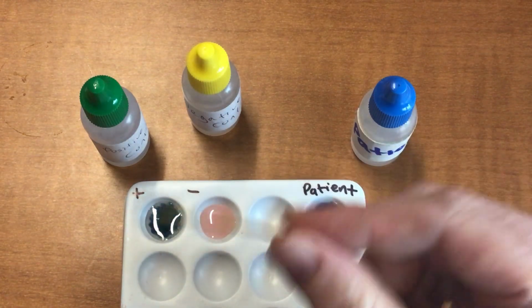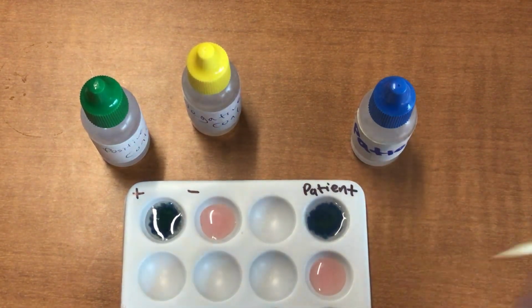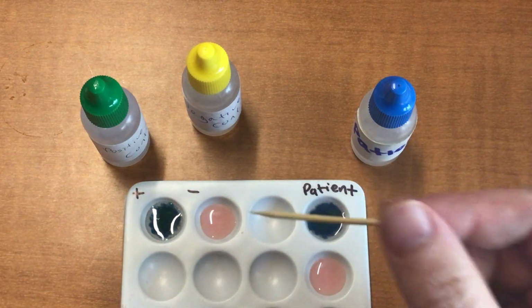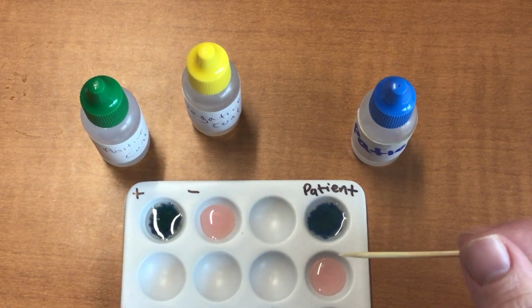And what they'll do is take a photograph of this, take a scan of this, and send it back to the doctor, and the doctor will know, all right, our patient compares to positive salmonella, or our patient compares to negative salmonella. And that's one of the ways that chemical testing is done to see if patients have a disease or not.